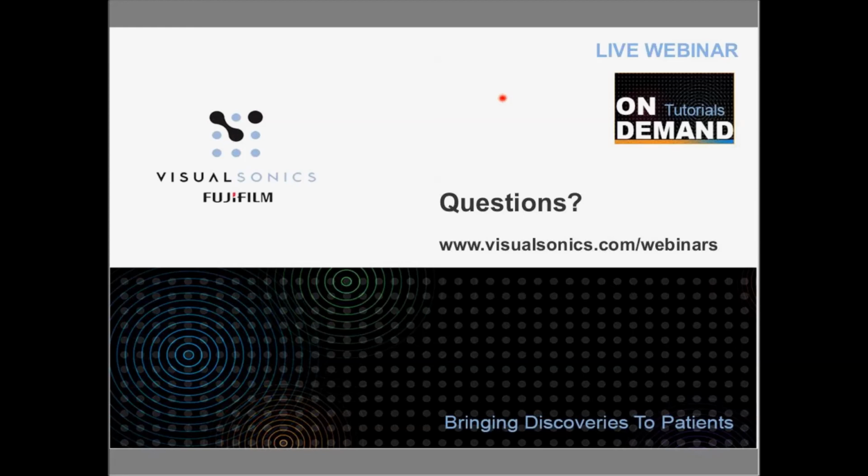But if you're looking at really subtle changes, those early changes that happen with exposure to drug, maybe changing a gene, and then as the animals develop, their heart function changes, those early changes are where VevoStrain really comes in. Now, you can also make the argument that VevoStrain provides one nice centralized platform, where you've got your functional data and your strain and strain rate data all combined into one platform. So I think that's something to keep in mind.